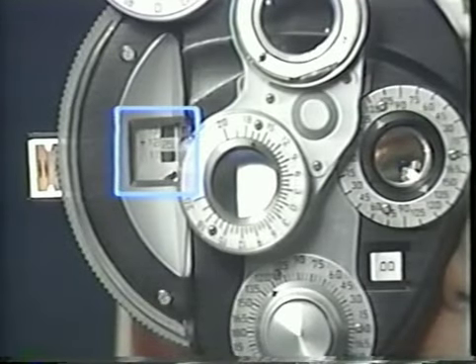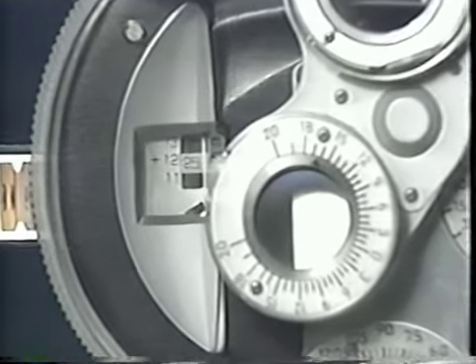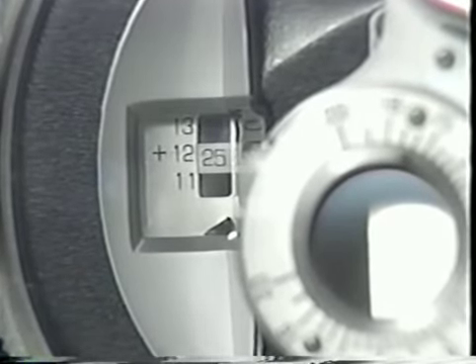If the refractive findings are high, more than 5 or 6 diopters of sphere, the vertex distance of the refraction should be taken into account, the distance from the patient's cornea to the corrective lens. The Reichert phoropter has a sighting device on the side to view the patient's cornea. By using the forehead rest to align the apex of the patient's cornea with the marks in the sighting device, the vertex distance is set at 13.75 millimeters.